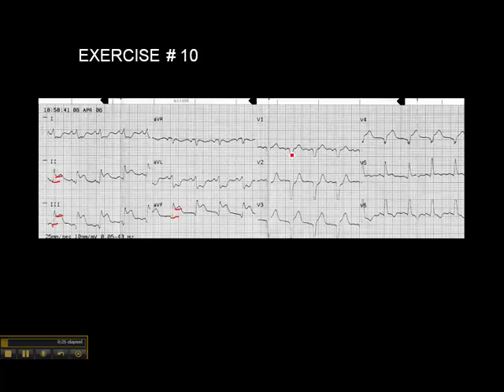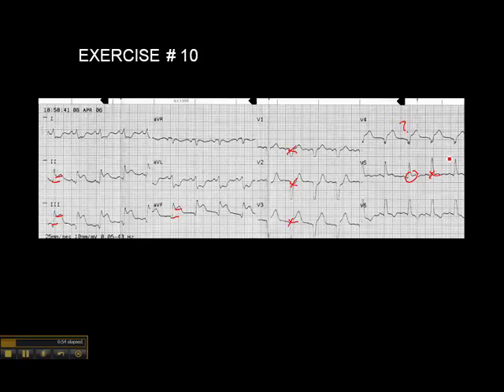We don't see any elevation in V1. There's no elevation in V2, no elevation in V3. V4 looks a little bit like there's some ST elevation, but we don't see it in V3, so it doesn't meet the criteria for two anatomically contiguous leads. I don't see it in V5, although it looks like it a little bit, but it doesn't look like it in the other leads. There's no ST elevation in V6, and in fact there's ST depression in leads 1 and AVL.